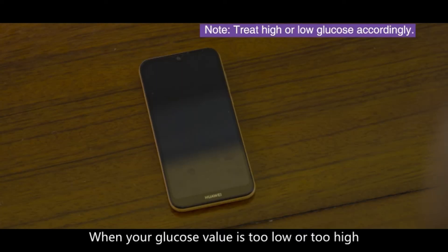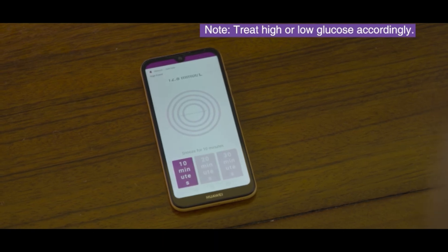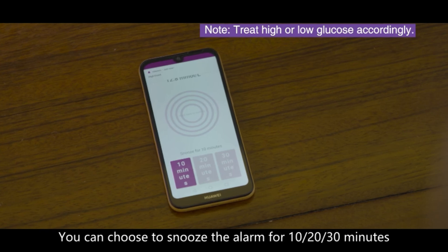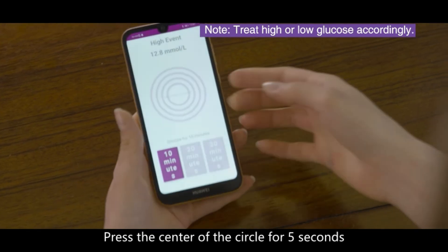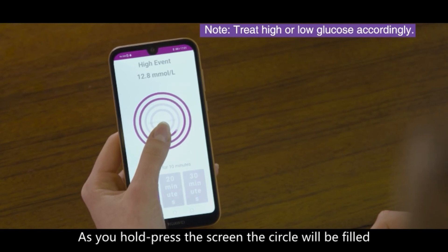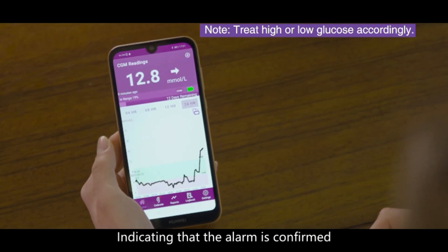The trend arrow helps you take actions to avoid glucose getting too low or too high. When your glucose value is too low or too high, there's an alarm. You can choose to snooze the alarm for 10, 20, or 30 minutes. To dismiss an alarm, press the center of the circle for 5 seconds. As you hold or press the screen, the circle will be filled, indicating that the alarm is confirmed.